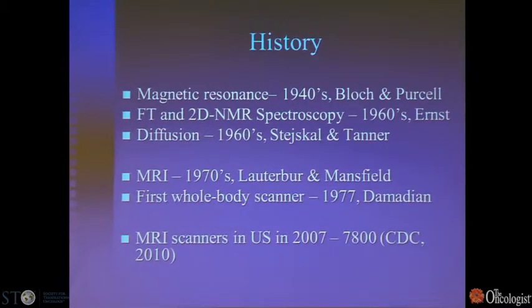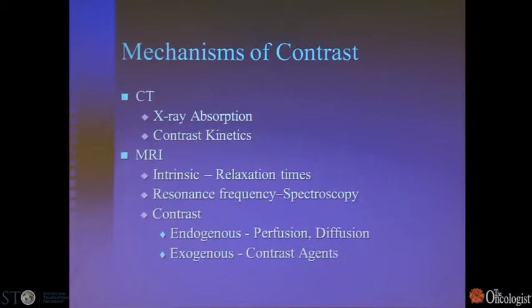By way of historical perspective, I just want to remind people that much of magnetic resonance, pulsed spectroscopy, diffusional measurements with magnetic resonance, these were all developed decades before MRI itself was invented. The latter occurred in the early 70s.